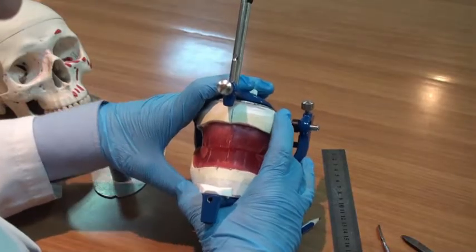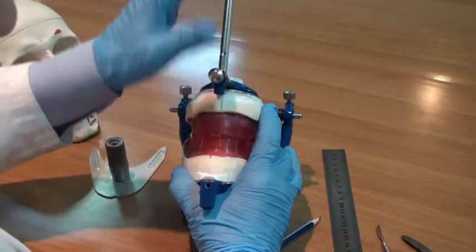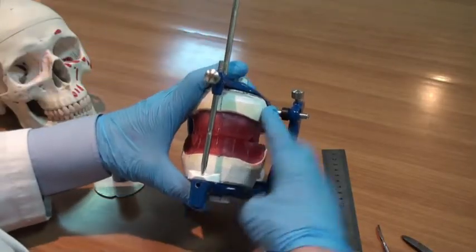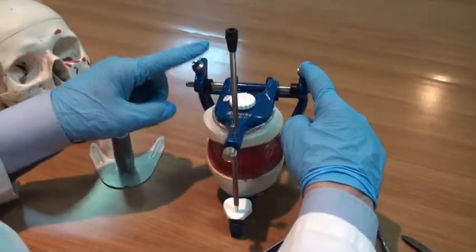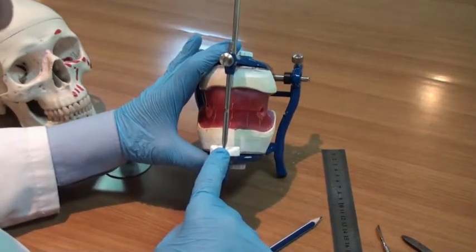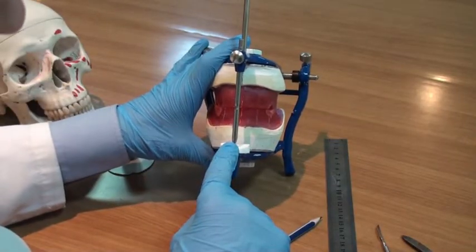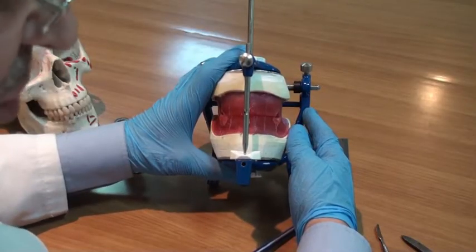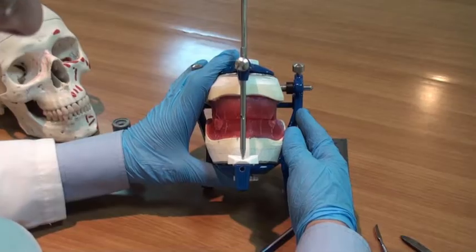This can give you a permanent reference to the midline. Therefore, you have noticed that we have a 3-point support for the upper member of the articulator. This 3-point reference: we have the two condyles posteriorly and the incisal pin anteriorly. These 3 points establish the movement paths of the articulator and subsequently the teeth against each other.